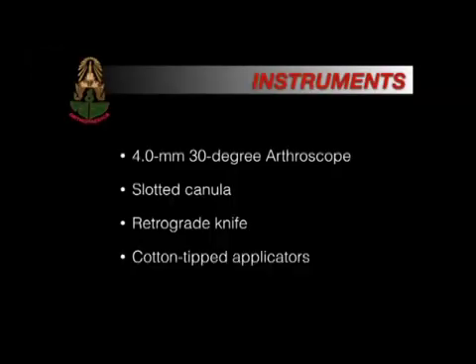Instruments required: a 4 mm, 30-degree arthroscope; slotted cannula; retrograde knife; and cotton-tip applicators.